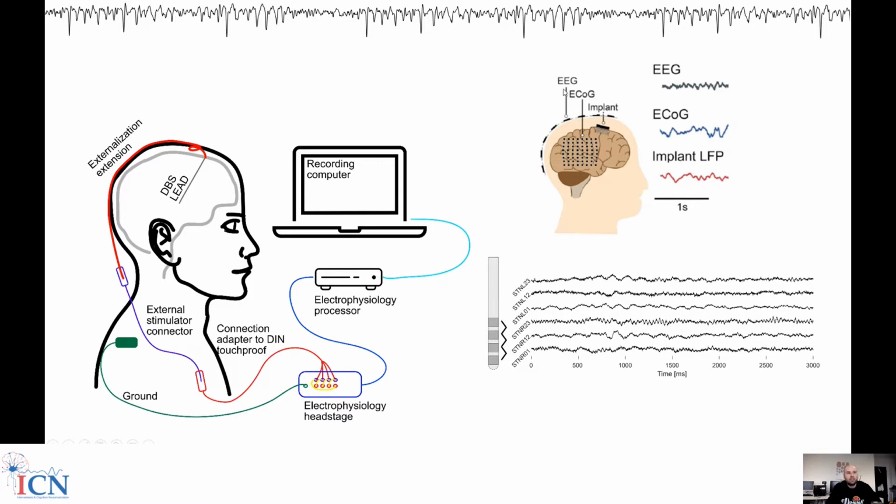Now, additionally, of course, you can also add some EEG, ECoG, or other kinds of modalities to your recordings. In Berlin, we have started to record ECoG in some patients. In addition, we almost always add at least minimal EEG electrodes on top of the head to get some cortical activity too. And often we also record some EMG.